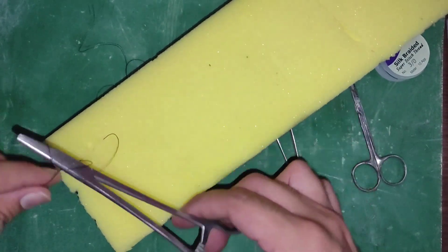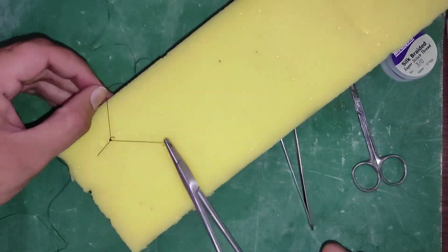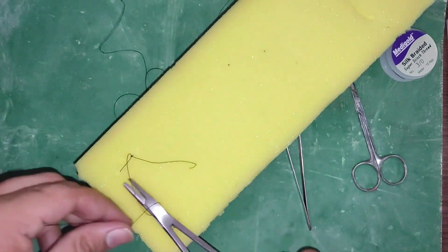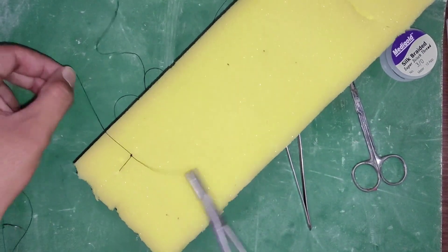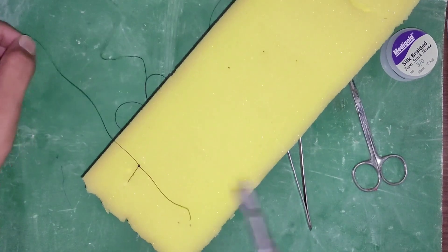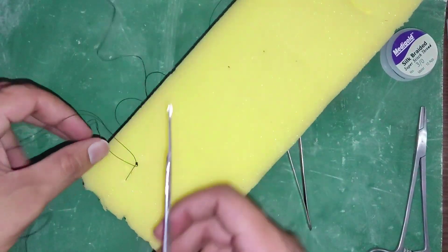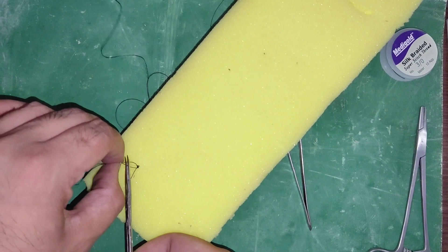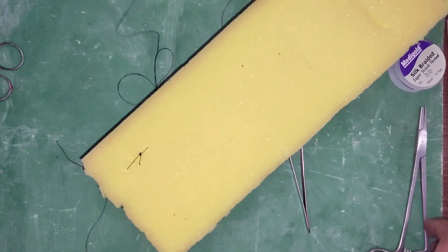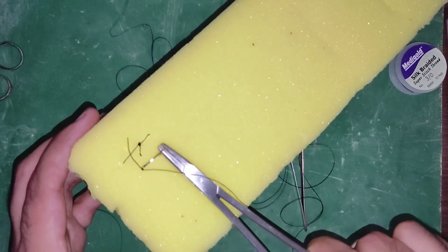To prepare a knot, first go in a clockwise direction, then one anticlockwise, and then again in a clockwise direction. The suture should be tied only to approximate the tissues — not so tight as to blanch — and the knot should never lie on the incision line.